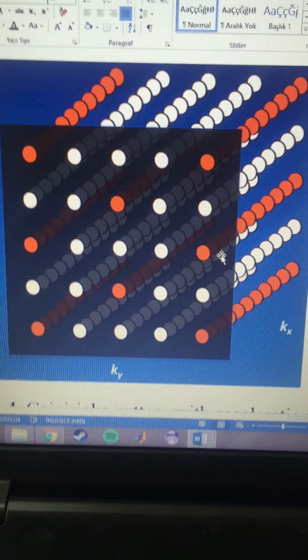My last example is the CAIPIRINHA pattern with acceleration in 2 directions plus phase shift of alternate rows. Here is our third image. In this figure, the CAIPIRINHA pattern has R equals 2 sampling in each phase encode direction.